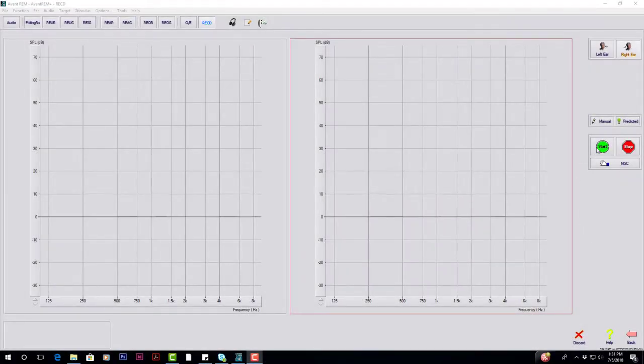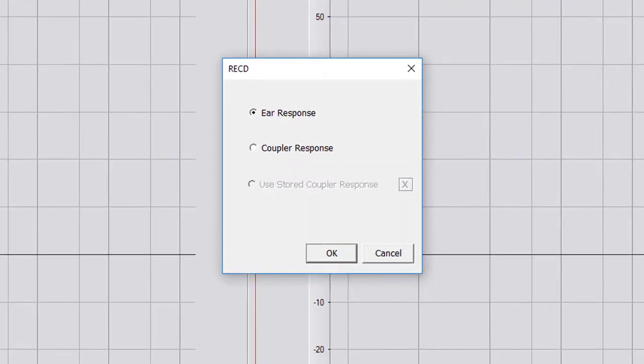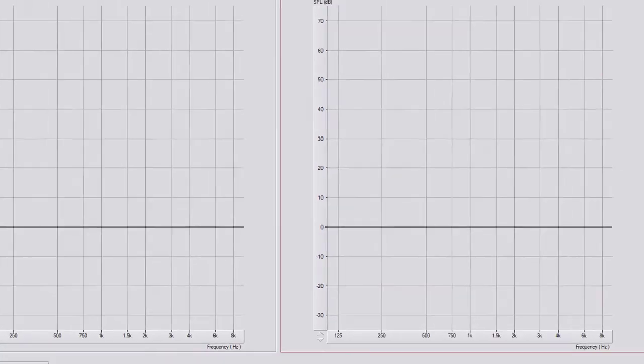Select the green start button to open the measurement type selection screen. Choose ear response and select OK to begin measurement.